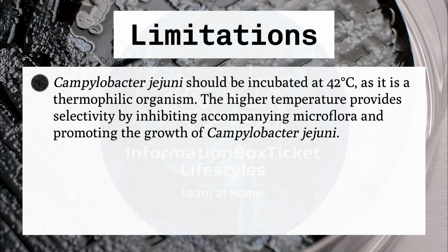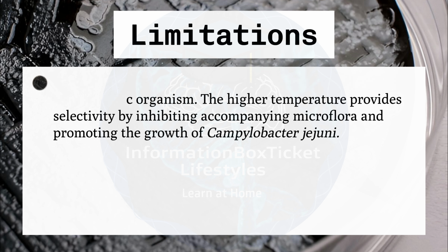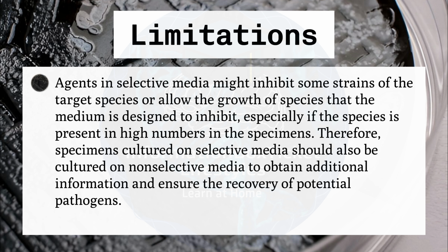Campylobacter jejuni should be incubated at 42 degrees Celsius, as it is a thermophilic organism. The higher temperature provides selectivity by inhibiting accompanying microflora and promoting the growth of Campylobacter jejuni. Agents in selective media might inhibit some strains of the target species or allow the growth of species that the medium is designed to inhibit, especially if the species is present in high numbers in the specimens. Therefore, specimens cultured on selective media should also be cultured on non-selective media to obtain additional information and ensure the recovery of potential pathogens.